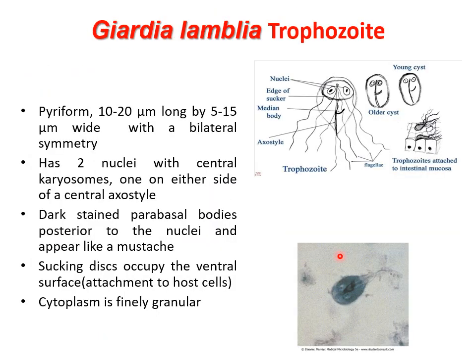Let us start characterizing the properties of the trophozoite stage, which is responsible for the symptoms of the foul-smelling diarrhea. First of all, these trophozoites of Giardia lamblia are pyriform and have a bilateral symmetry whereby an axostyle divides the trophozoite stage into two equal parts. The trophozoite has also two prominent nuclei, each of which has a central karyosome.